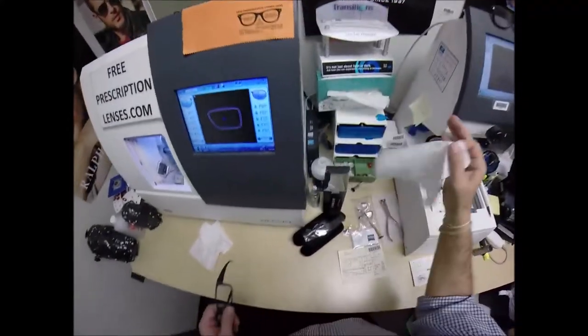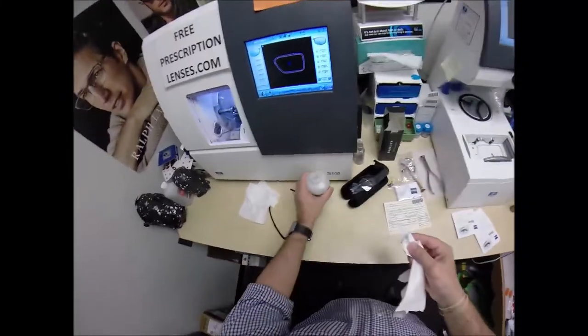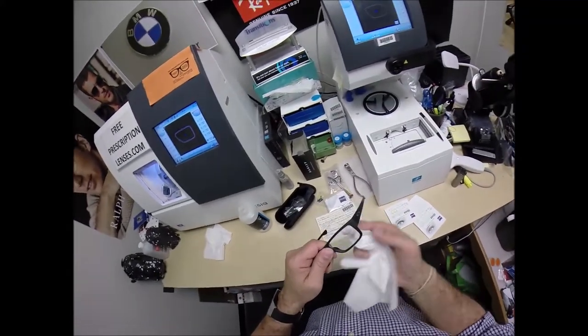This is called final inspection. You always want to inspect a pair of glasses before you either call the patient or ship them, so you know that it's perfect. As I clean your lenses, I'll mention that this purchase is tax-free and includes free shipping anywhere in the U.S. And Macon, Georgia is still in the U.S.